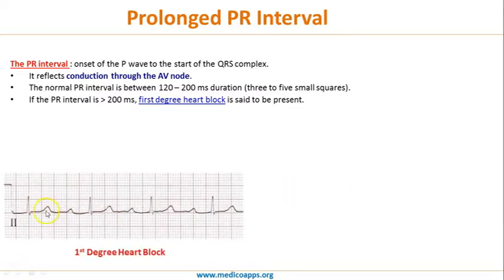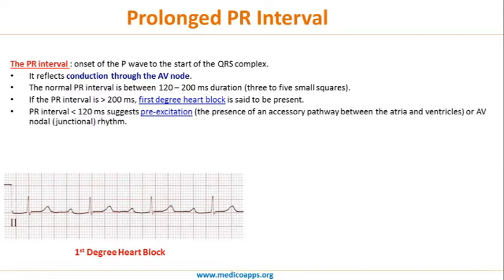As a reminder, we have already seen first-degree, second-degree, and complete heart blocks. Here we can see almost eight or nine small squares, indicating an increased PR interval. If the PR interval is less than 120 milliseconds, it suggests pre-excitation or the presence of an accessory pathway between the atria and the ventricle, through which the impulse is conducted at a faster rate, or it may indicate AV junctional rhythm — where the impulse originates from the AV node.